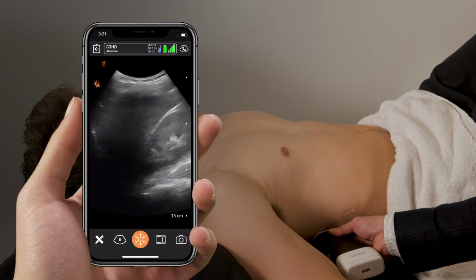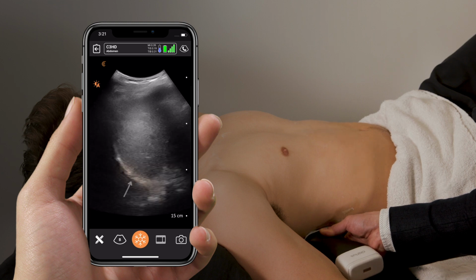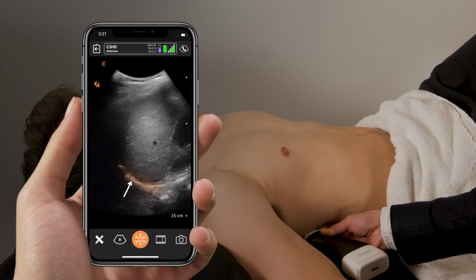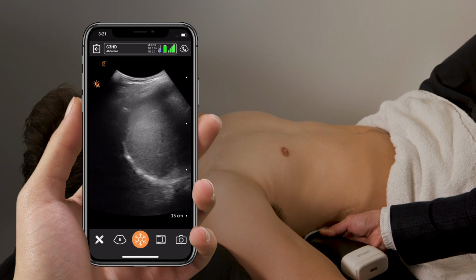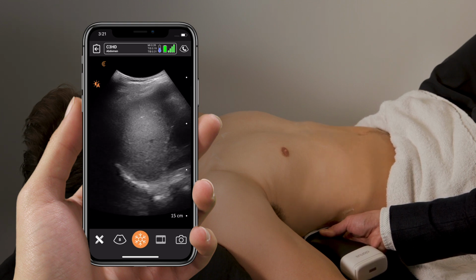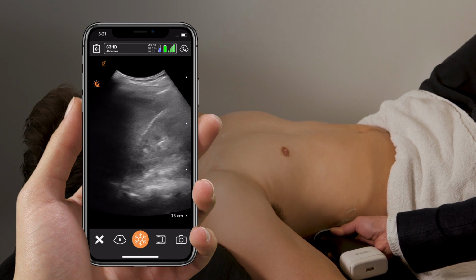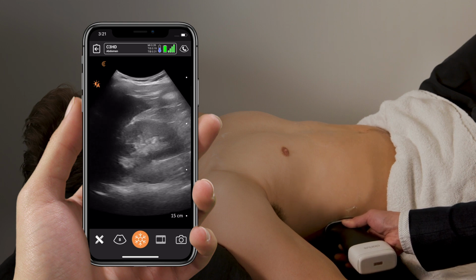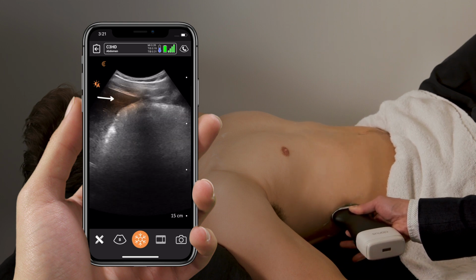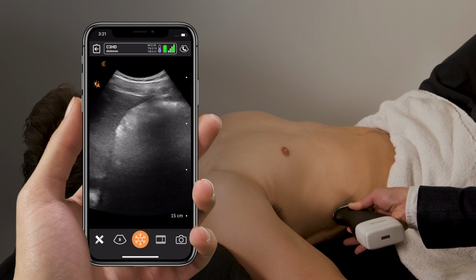At this point, it's helpful to also angle your probe upwards so that you visualize the diaphragm and look above the liver and above the diaphragm. Here we're looking for fluid above the diaphragm. This would suggest a pleural effusion, and in the setting of trauma, it would suggest a hemothorax. At this point, we also want to slide the probe inferiorly, and we want to actually visualize the inferior tip of the liver, because this has been shown to be one of the most sensitive areas for free fluid in the abdomen.